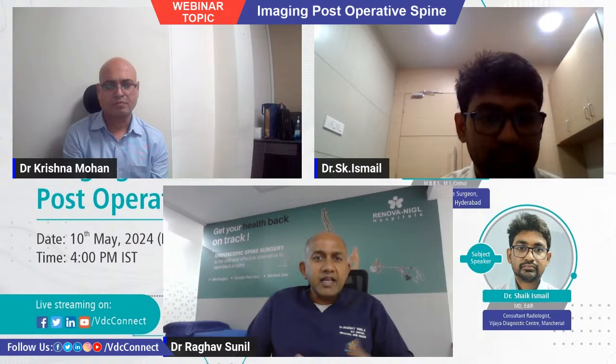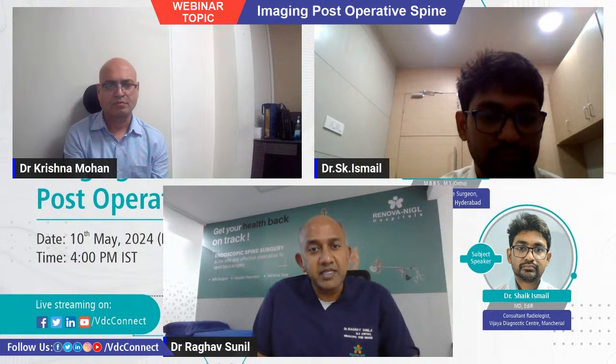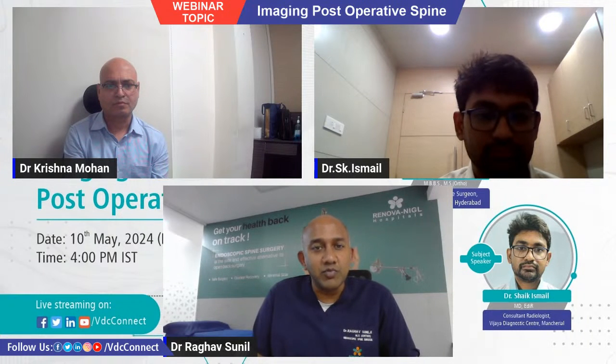And I do not advise people to do MRIs post-op continuously for all patients, but definitely if there is some doubt with the surgery, or if you want to document your surgery, or if there is any complication like any post-op hematoma or any few days post-op, if you are suspecting an infection or any other complication, you should definitely do an MRI. And I also do believe that we should communicate with the radiologist about the surgery we have done, so that they know what to look for and give us a heads up regarding any untoward findings.